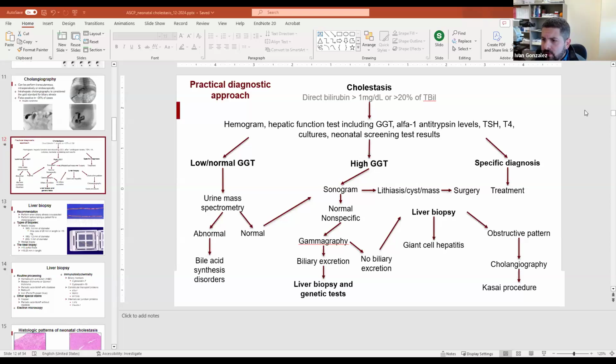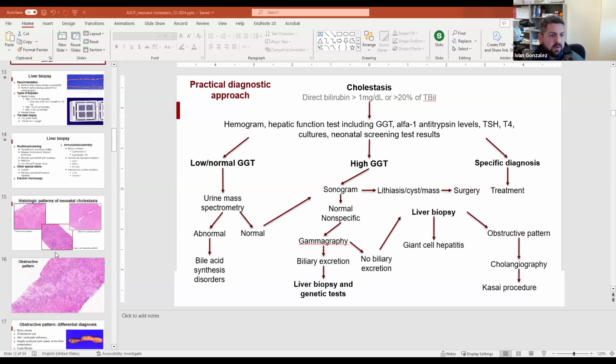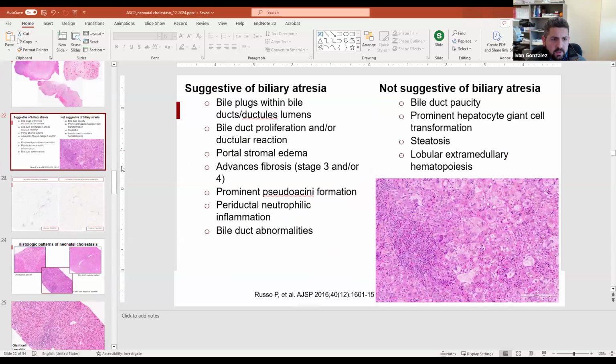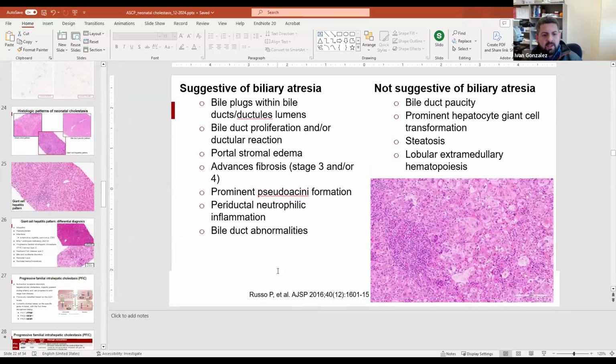Okay, can you put up the slide with all the findings of BA positive and negative? There's a question about how strongly we comment when there are negative findings. So I think they're referring to this really great study by Dr. Russo. This study is super interesting. A bunch of pathologists, I think 15 plus, from the network sat down together. If I remember correctly, they reviewed close to 400 biopsies and evaluated all these different features, trying to determine which were associated with BA and which weren't.